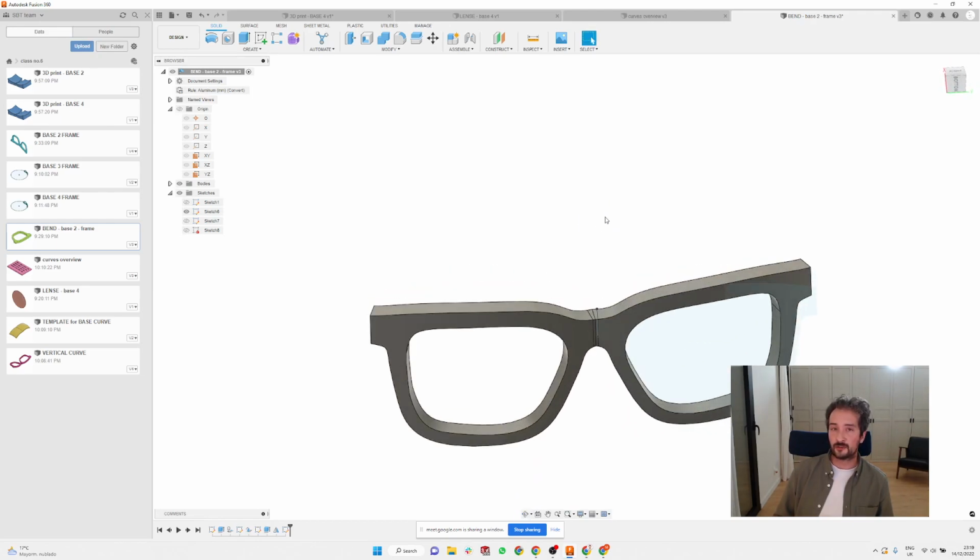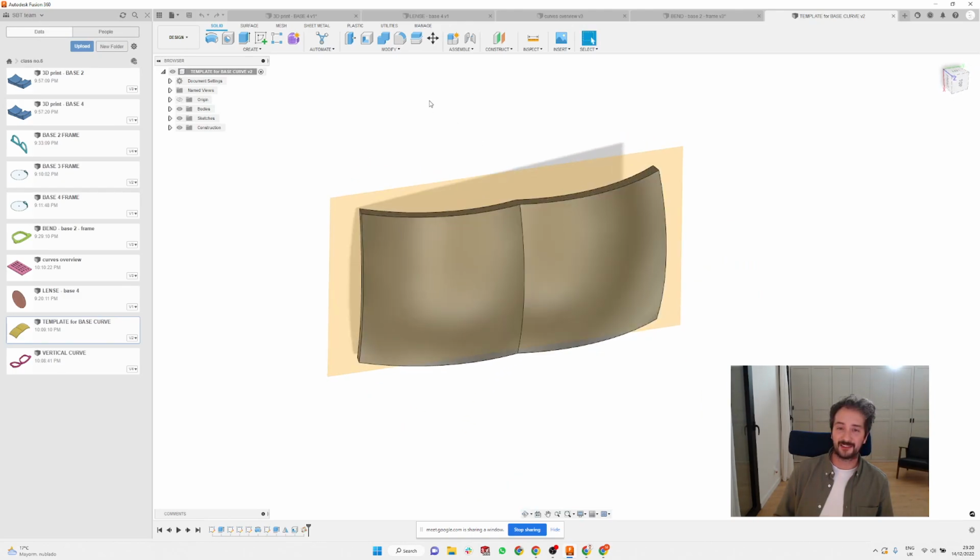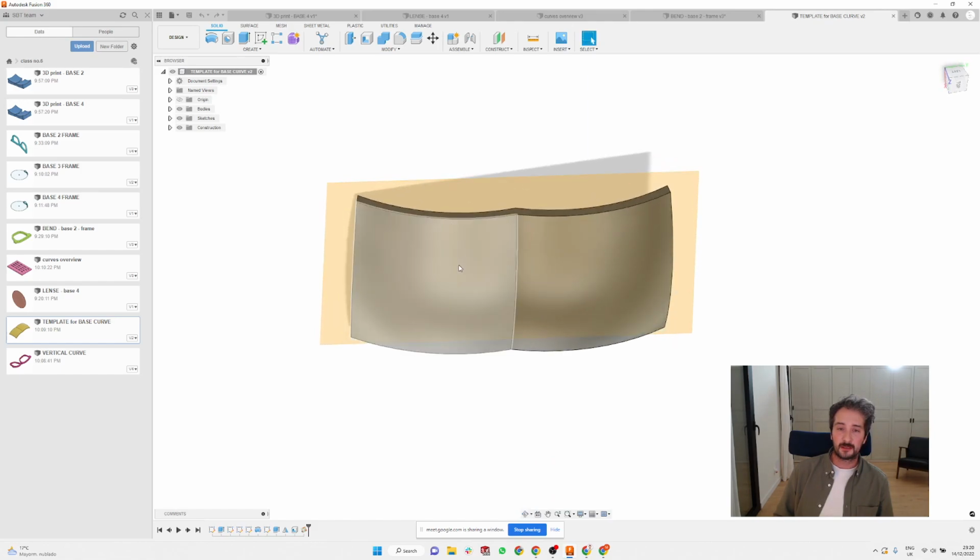But I can also show you the other way to do it, and it's a bit more complex because we need to basically create ourselves, yeah, it's a weird shape, but it's basically two base 4 lenses here and here, and I'm just going to extrude the frame against it, and I'm going to show you how it looks.